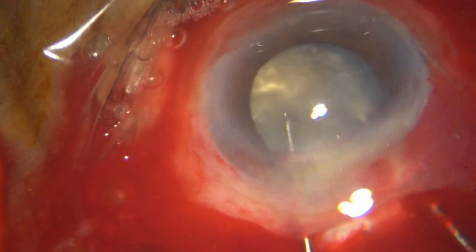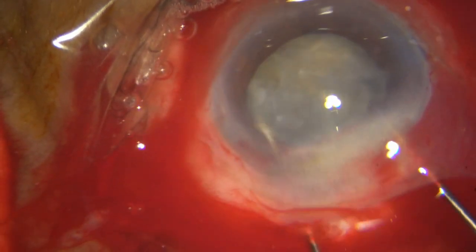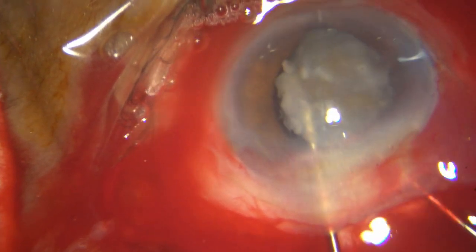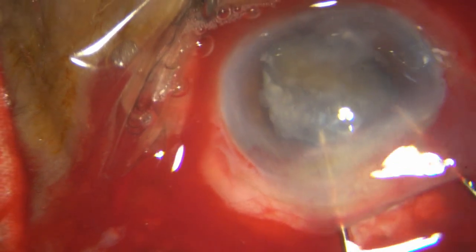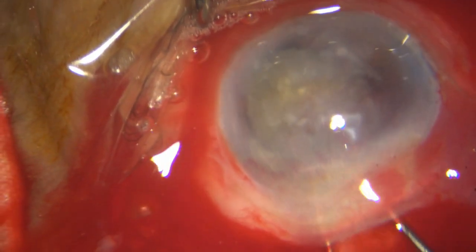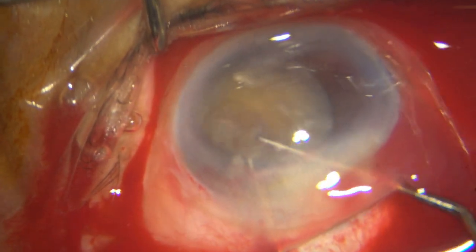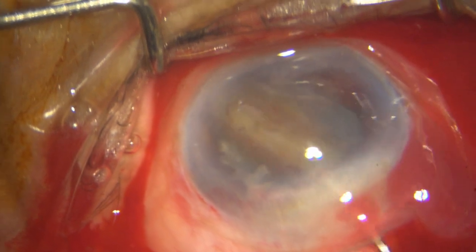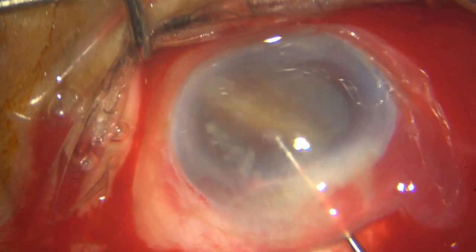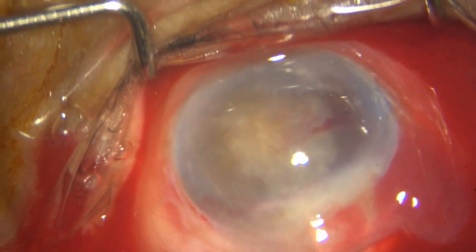I go to the other pole, and I have got this pole, and again the nucleus is tending to tumble. Sort of got it to rotate, and you can see that tumble there. That can indicate that that side of the bag is probably weak. To be very careful, so I just brought it out.